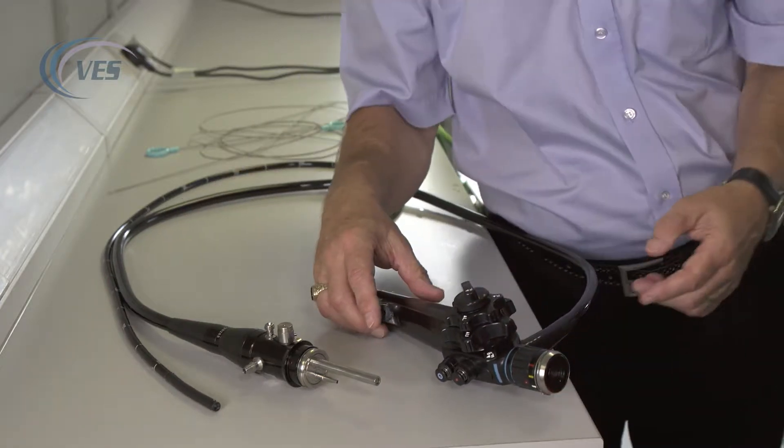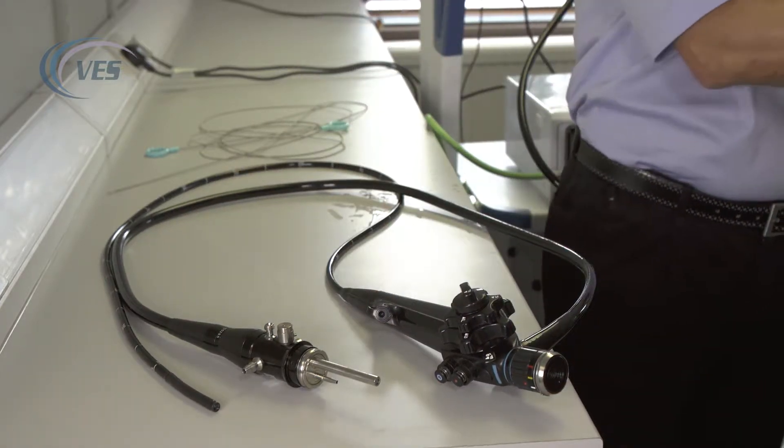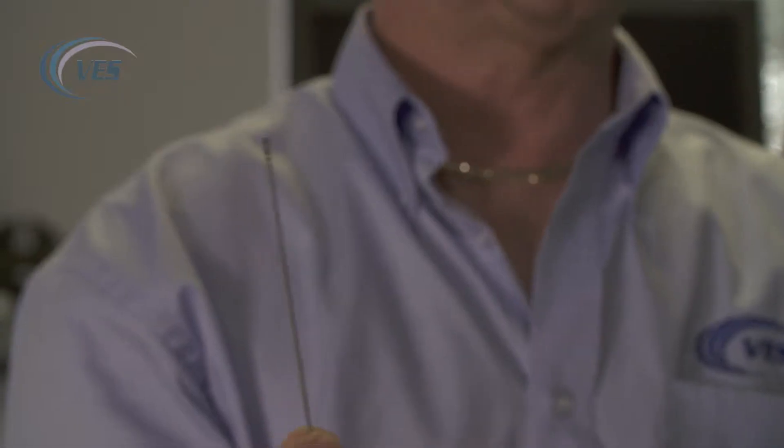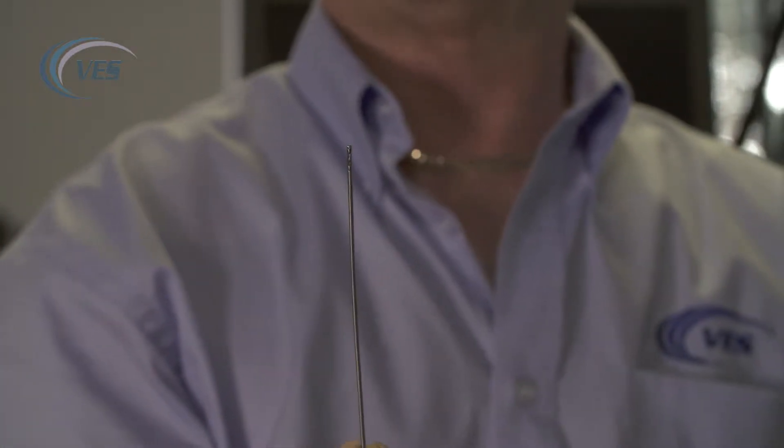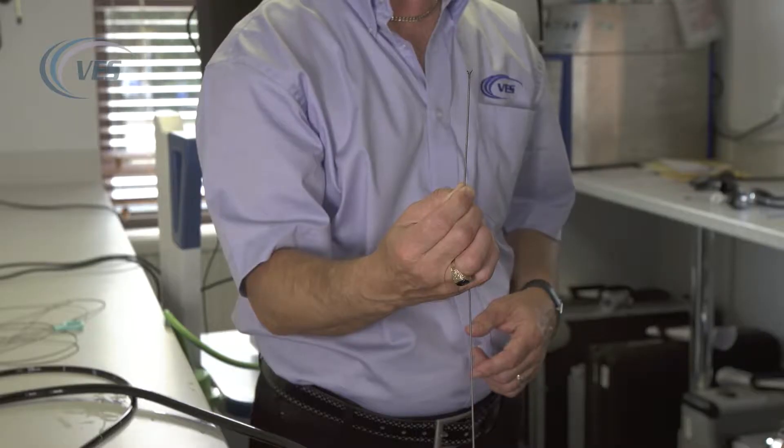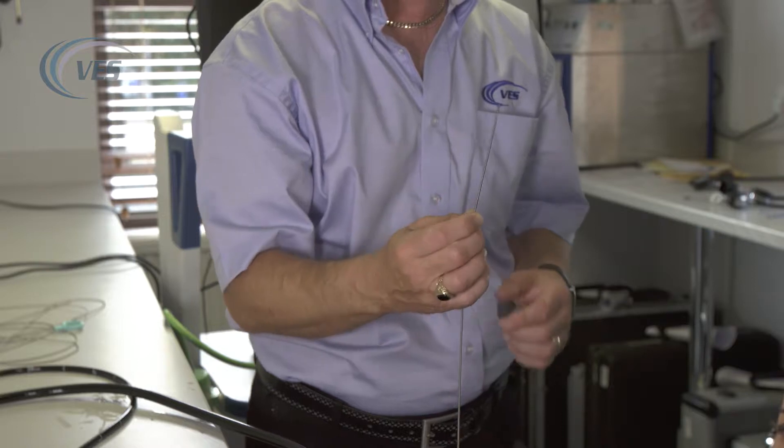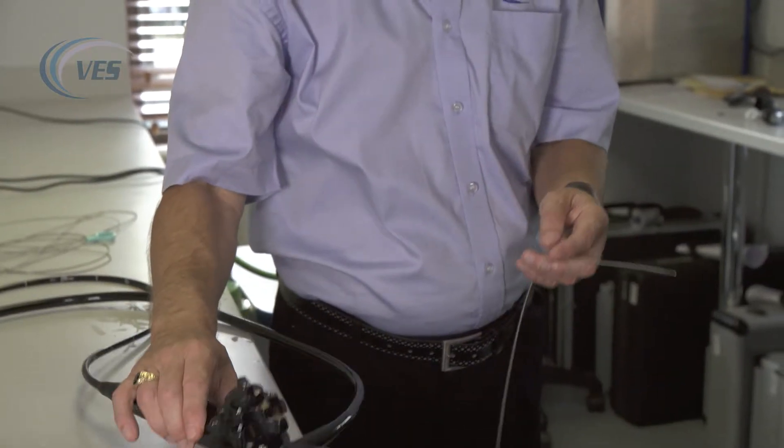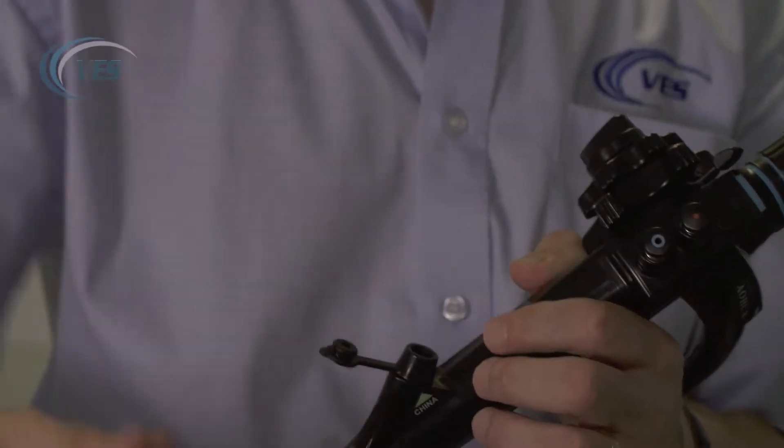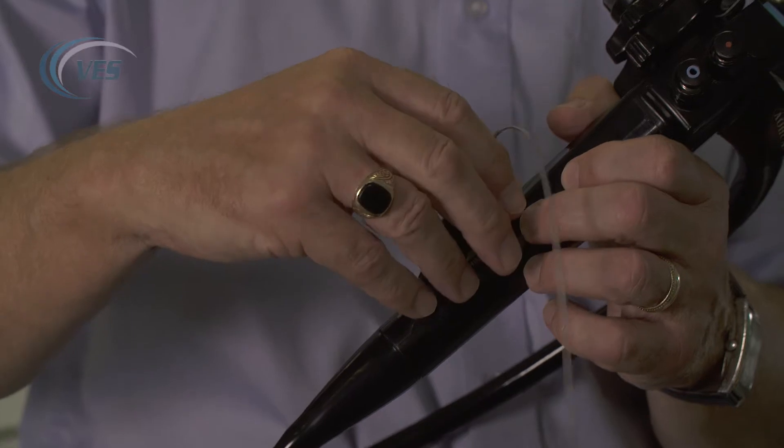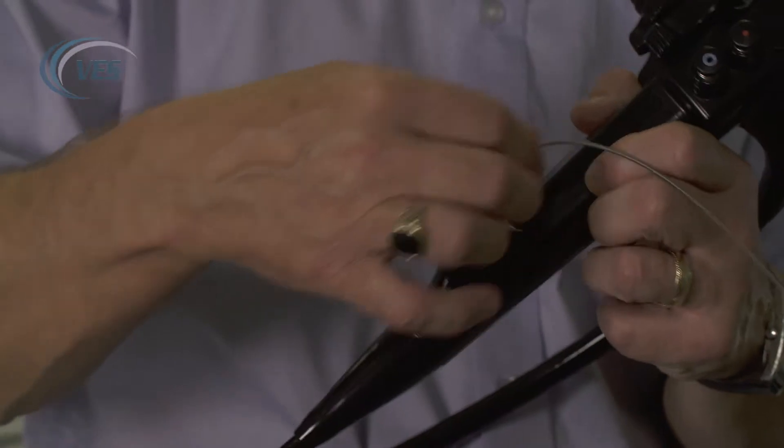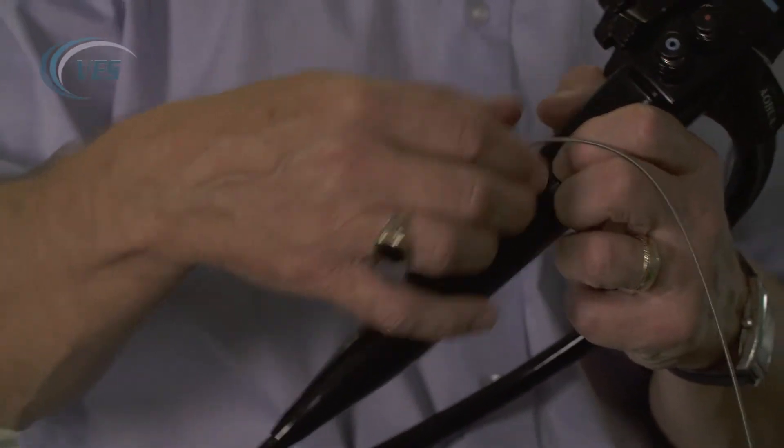It's important to make sure that the biopsy forceps prior to being introduced through the biopsy port are closed and not open. If they are open and introduced into the biopsy channel, you're going to cause a lot of damage. To feed through, take the port off the biopsy cap and just feed that through. With short movements, feed your instrument or cleaning or cytology brush through.